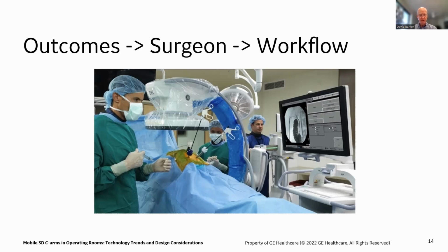You'll see this picture. You can identify the surgeon. The surgeon's the one looking at the screen, probably at this point, either working with the catheter or some contrast with the patient. And you also notice that the C-arm is independent of the surgeon.